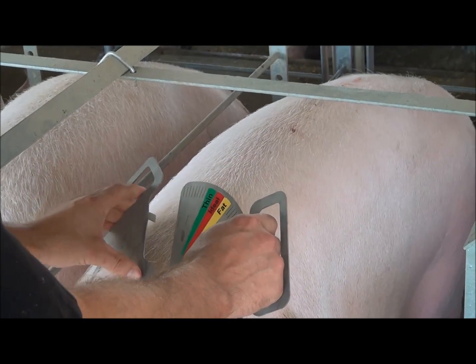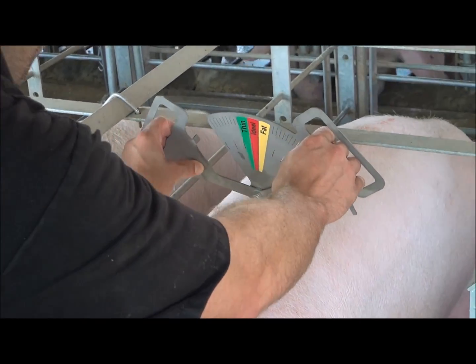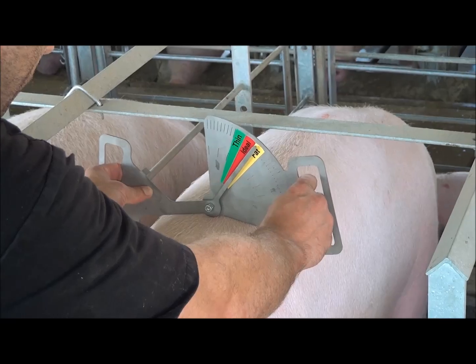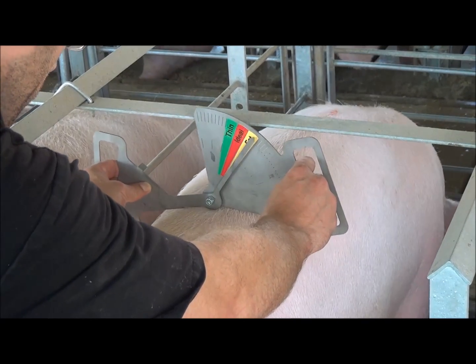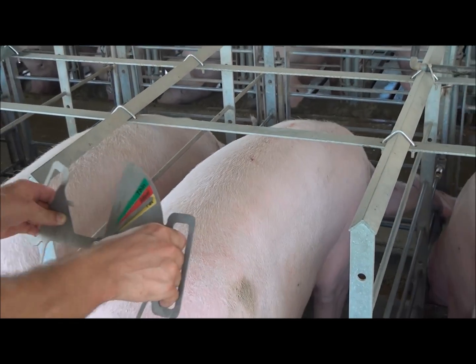The other way to hold it, which is how it was kind of designed, is to put your fingers right in there. Bring the tips down so they just touch the edge of the sow, and you can see that she's in ideal body condition.